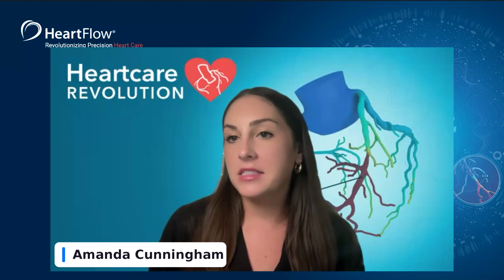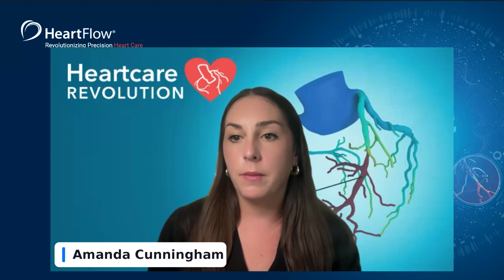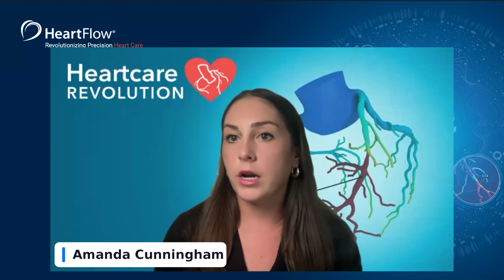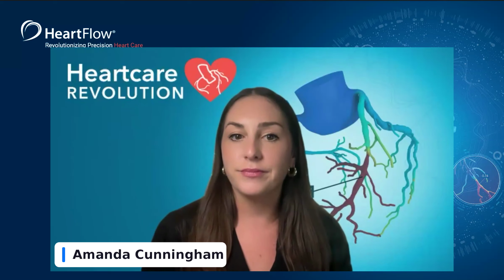Yeah, absolutely. So it's best you can do the test injection. You can give your patient breathing instructions, and then go ahead and give them the nitro. You can do the calcium score, and then you want to make sure that it's 5 minutes after it's dissolved. So by the time you do the calcium score and you get to the coronary portion of it, it should be about that 5-minute mark where it's after it dissolves. So you just want to make sure it's fully dissolved before you proceed.